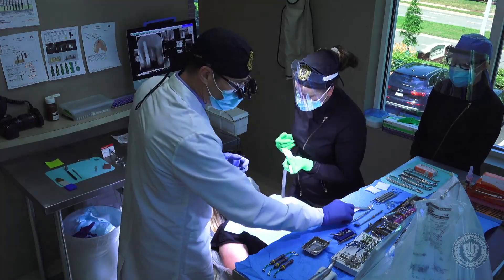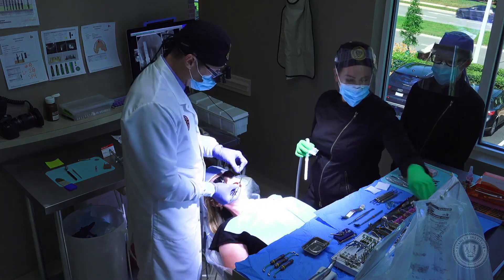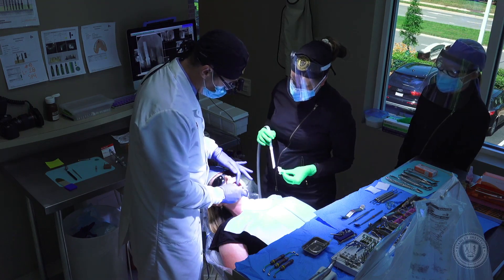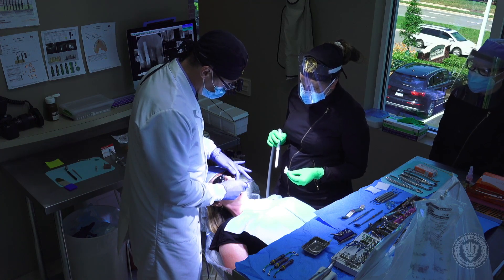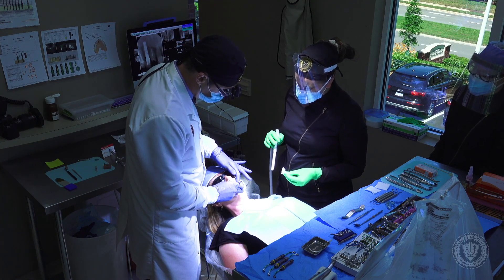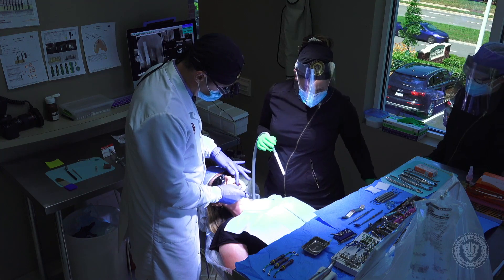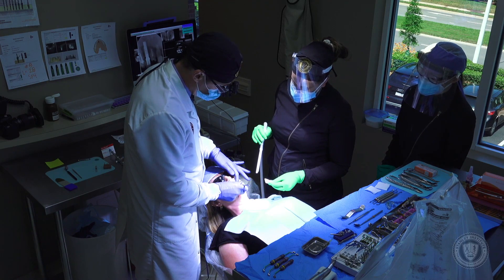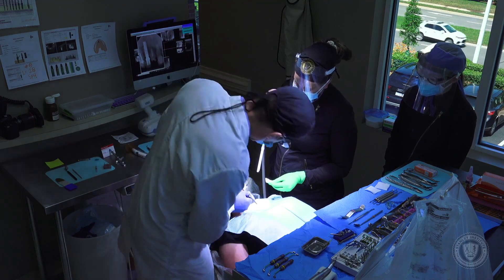The patient's already been anesthetized. We're starting with a 15 blade and a round scalpel handle — this one's from Hugh Freedy and allows very pencil-like movements with a great tactile feel. I'm going to go intrasulcular here. I don't want to lay a flap; we're going to do everything we can to do this flapless. The reason is we don't want to compromise the blood supply. Many of the things you'll hear me talk about today come from Turner's work, and I've been following those principles for years — they work really well.